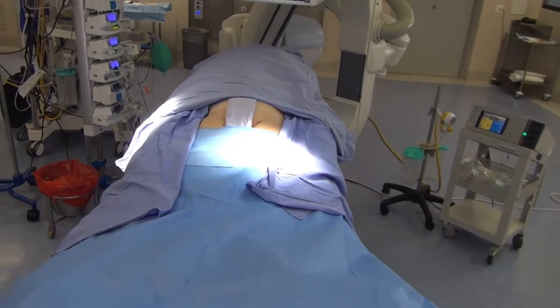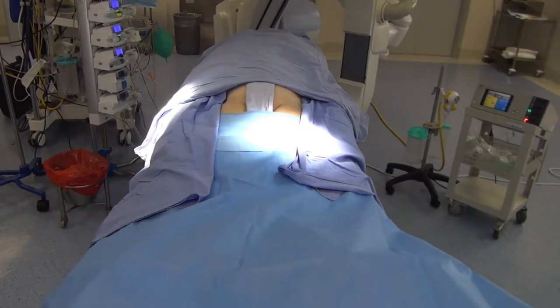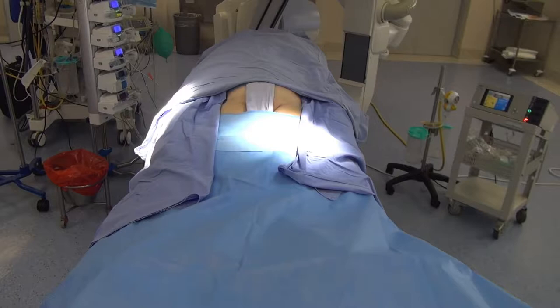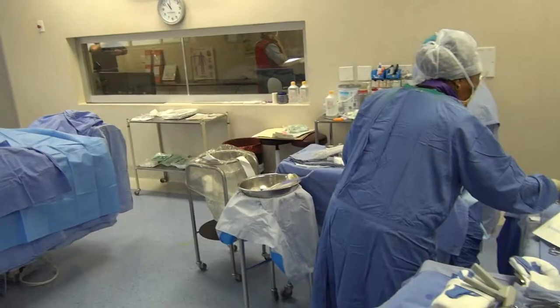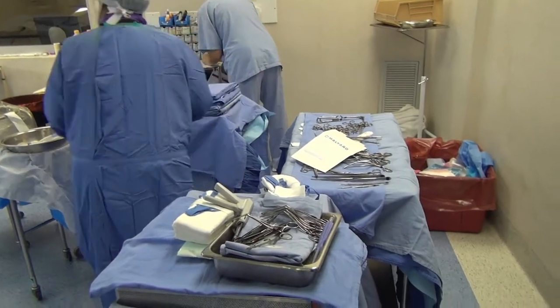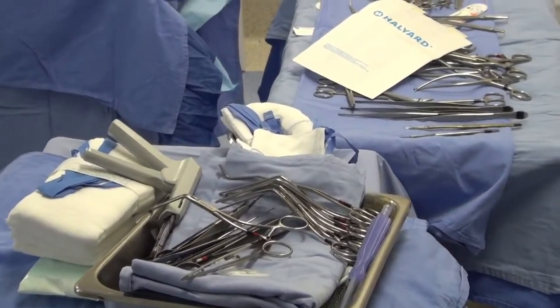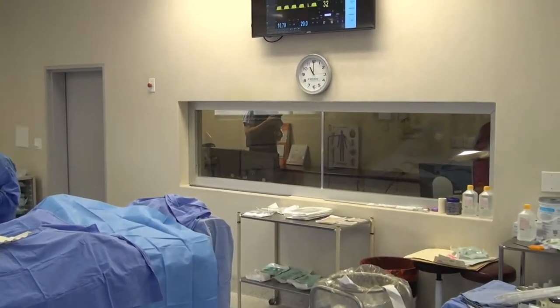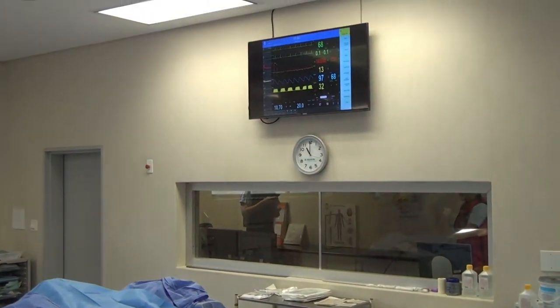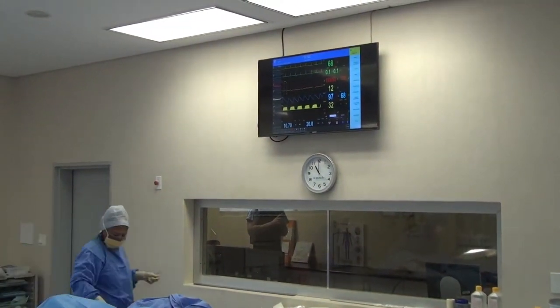In this case the patient is already under general anesthesia. A central venous catheter has been placed for fluid administration and an endotracheal tube is placed for ventilation. The theatre nurse has already prepared the lower abdomen, femoral areas, and upper thighs with an appropriate antiseptic solution and is now preparing the area with sterile drapes. Only the femoral areas are left open. The theatre nurse has also prepared all her equipment in advance, and even tools that are not used routinely are at hand. The anaesthetist and the whole surgical team have access to the patient's vital signs on at least two monitors in this theatre.